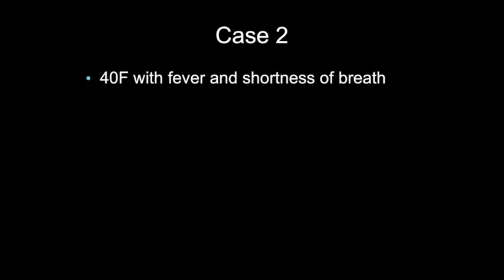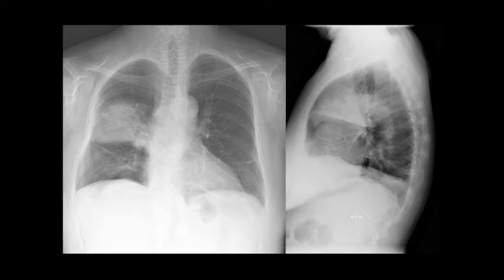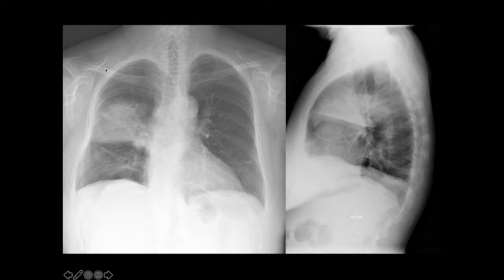Case two: 40-year-old female with fever and shortness of breath. Heart and mediastinum are okay, no shift, no abnormal contours — there's some calcification in the aorta. Comparing lungs on both sides, there's clearly something very abnormal in the right lung. No pleural effusions or pneumothoraces, no free air. Soft tissues and bones are okay. Checkpoints — apices, hyla, retrocardiac, retrodiaphragmatic are okay. The main abnormality is here.